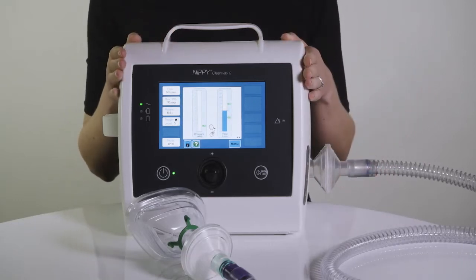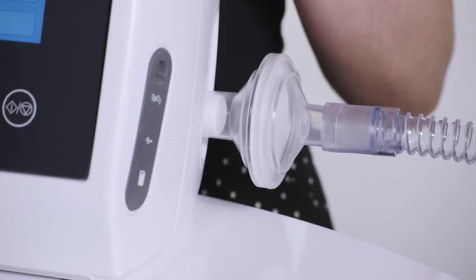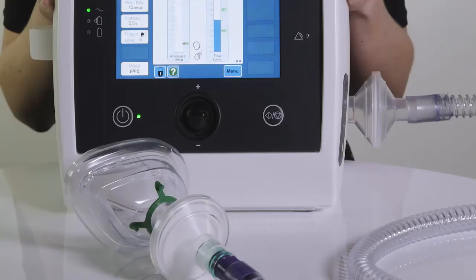It is possible to double filter when using the Clearway 2 — that is, to place a bacterial filter both at the patient end and the device end of the breathing circuit. This should not adversely affect the performance of the device or the delivered treatment.